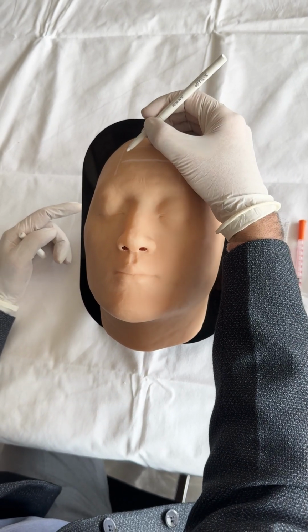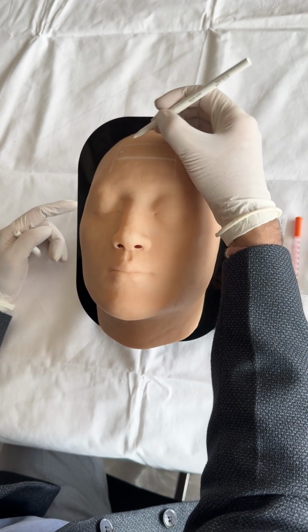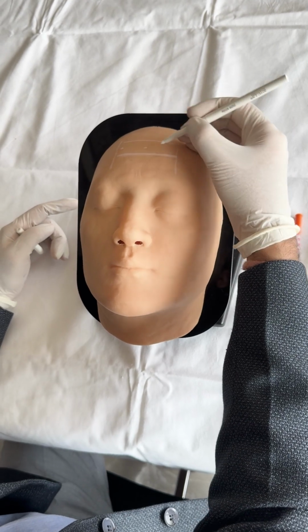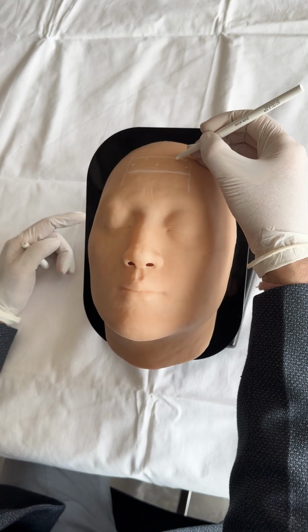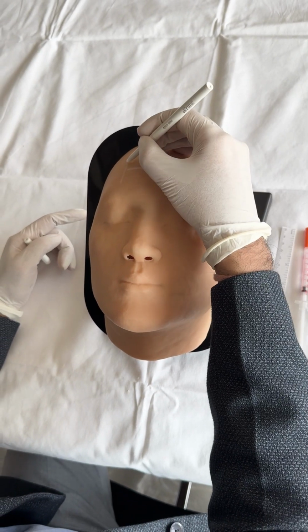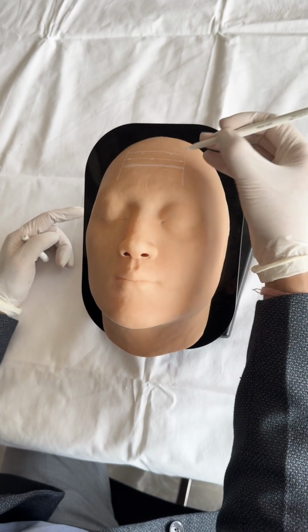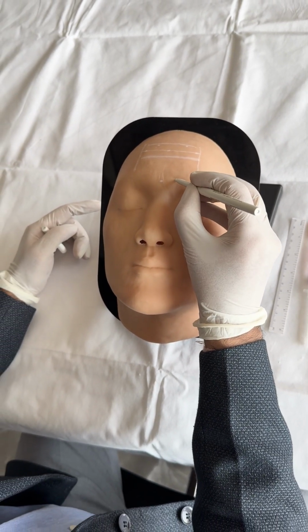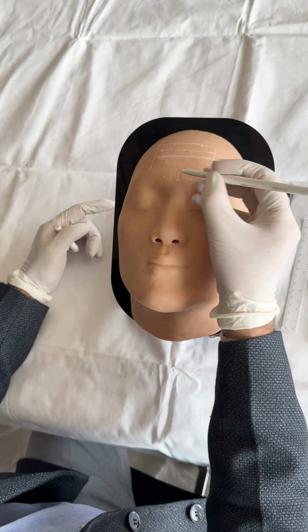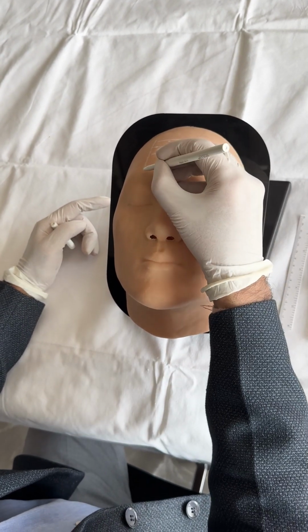For the purpose of demonstration, I am using the M technique here and marking the points on the forehead and the brows. Similarly, if you want to do the crow's feet or bunny lines, mark the same points with the help of a skin marker.